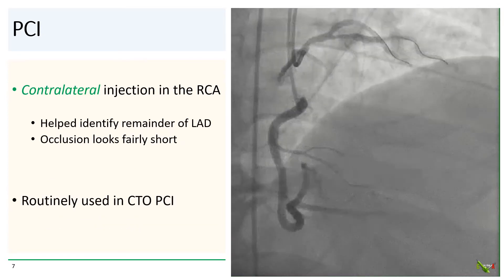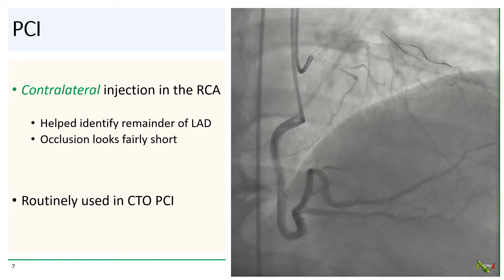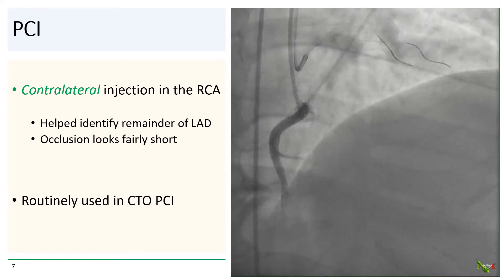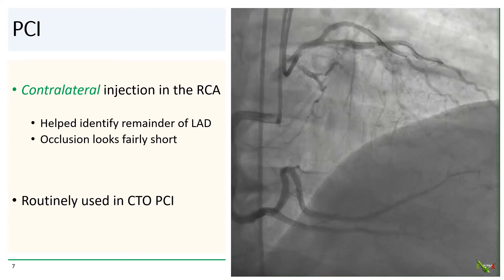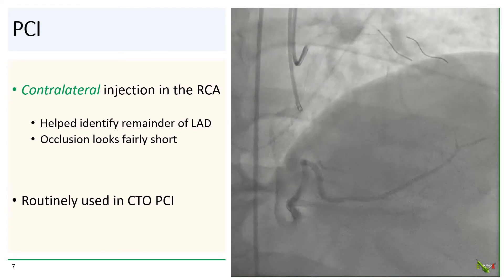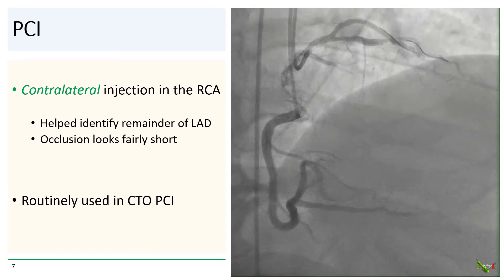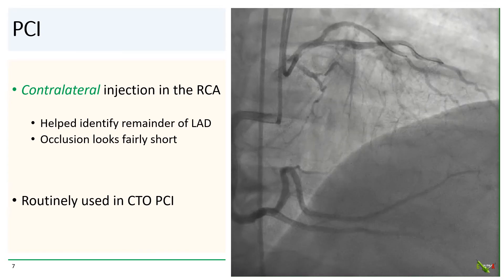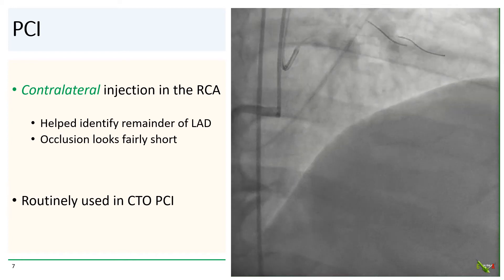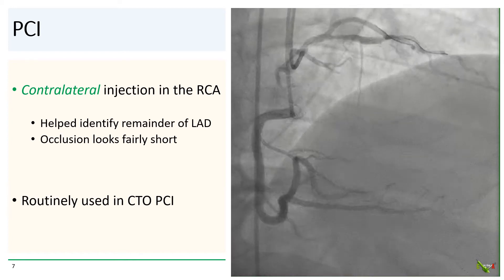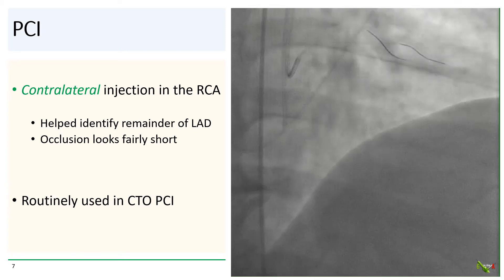In situations where there are collaterals, contrast injection in the contralateral vessel is often useful to locate where the occlusion is. So we went ahead and obtained femoral access and injected the RCA. This helped localize the remainder of the LAD, and the occlusion itself actually looked relatively short. Contralateral injections are routinely, if not universally, used in CTO-PCI.